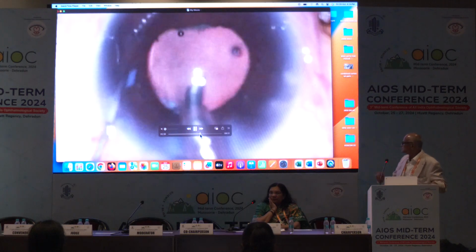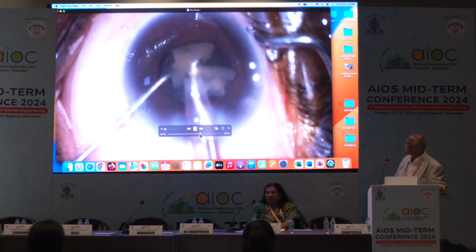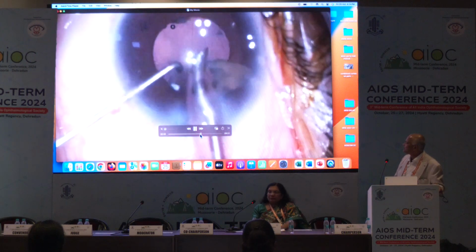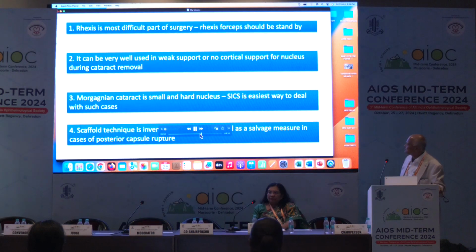Okay. So you have seen this, the small part removed. I have put a visco and then I have removed the same case. So that part had remained. So I put a visco, then I brought it out, and then I completed this. So it is very easy, but you will have to take care of that.